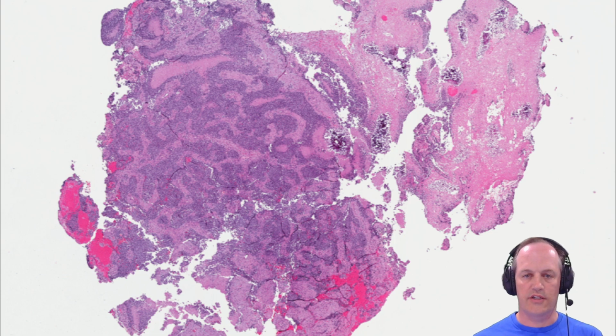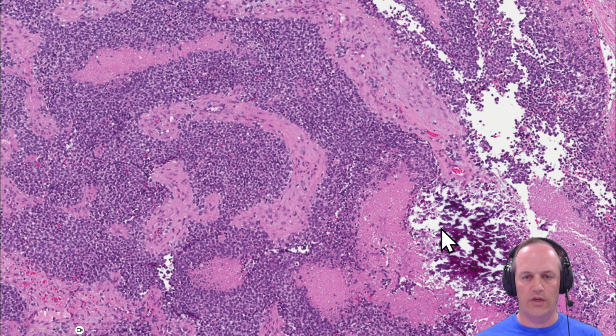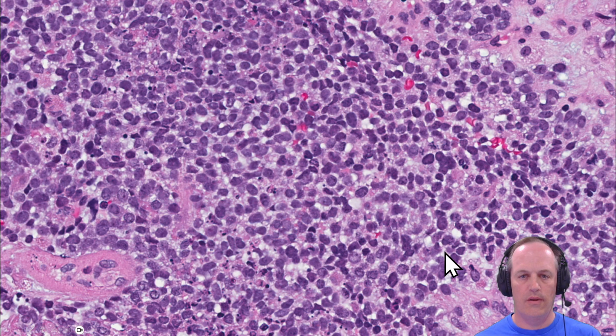In a histologic section, what you see right away is this is pretty blue, but there's a lot of these spaces for large vascular channels, and there's some necrosis here. There's some calcifications here as well. So you can see these pretty broad fibrovascular cores in this example, as well as that necrosis and some calcification.